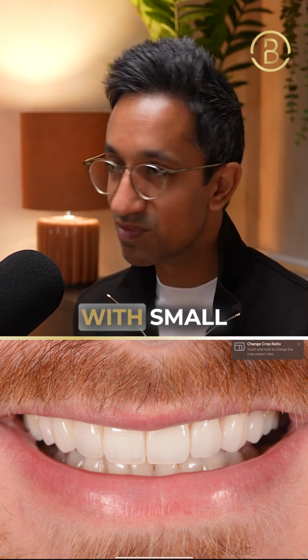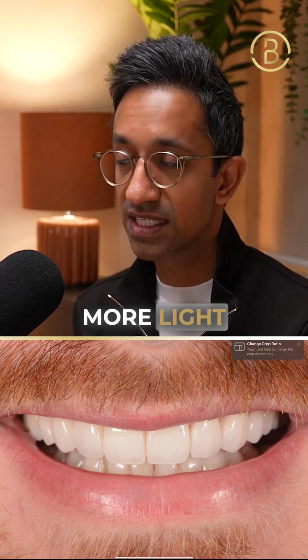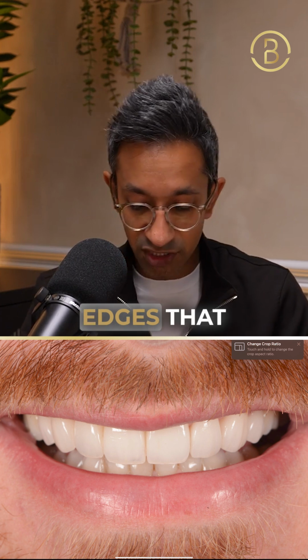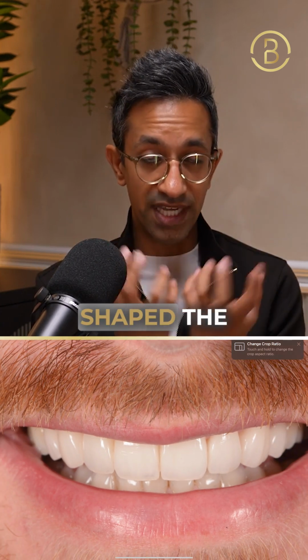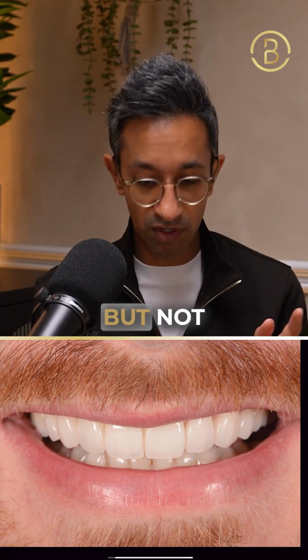You never see someone with small white teeth. It's always big white teeth, and that's because when you have whiter, more opaque teeth, it reflects more light, and so they don't look as natural. They look big, big, big. And in his case, we didn't want that. So we went for natural tone, natural color, edges that mimic nature, translucency, texture, and we shaped the teeth to give the impression of good proportion, but not massive teeth.